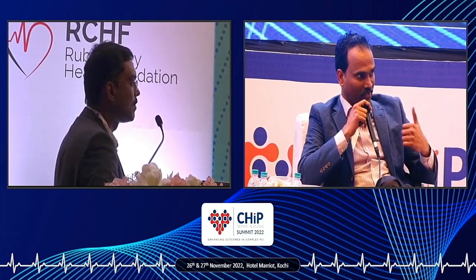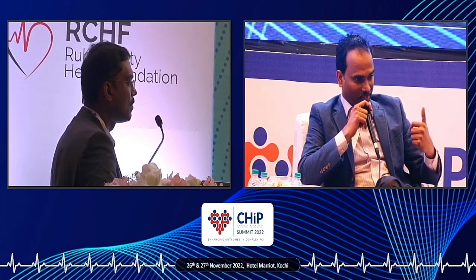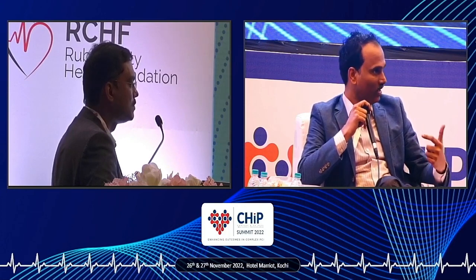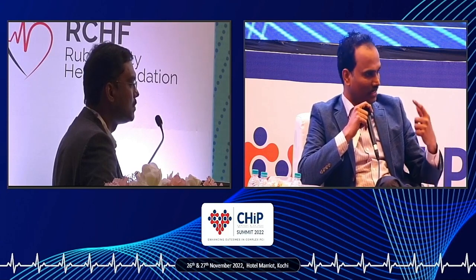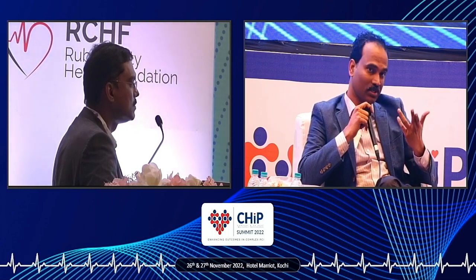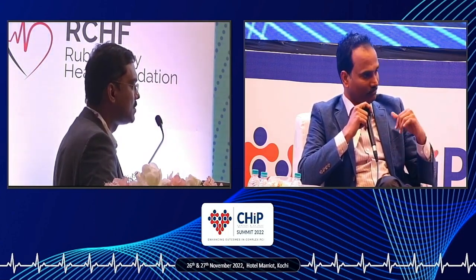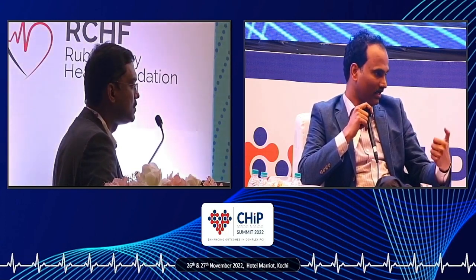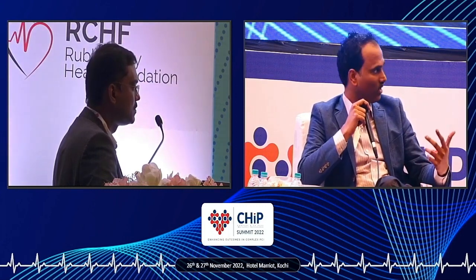So, if the pathology is under-expansion of the stent, and the reason for under-expansion is calcium, once you have deployed a stent and it is under-expanded, your options are limited. Again, in those situations also, laser comes to your rescue. You can use IVL, but laser is one modality. So diffuse intimal hyperplasia, and under-expansion where the reason is calcium sitting behind the stent, I think these are the two situations.